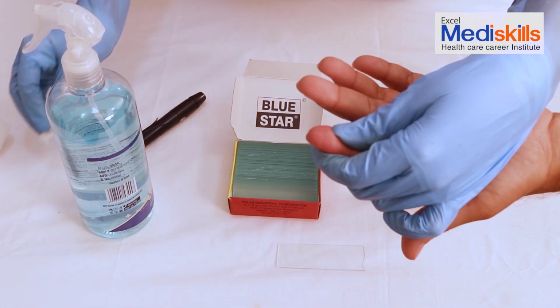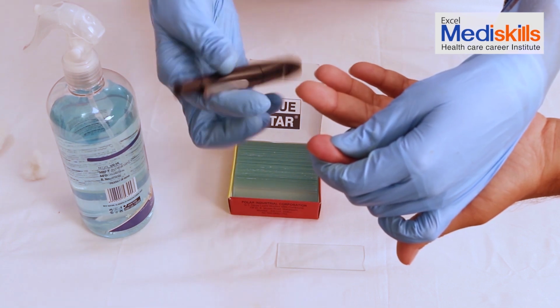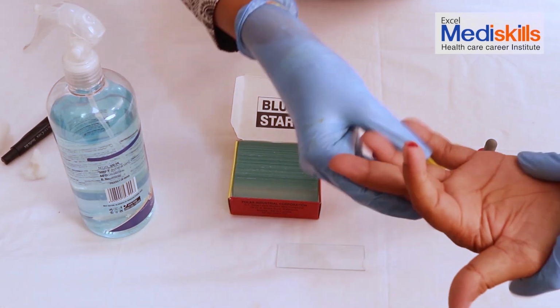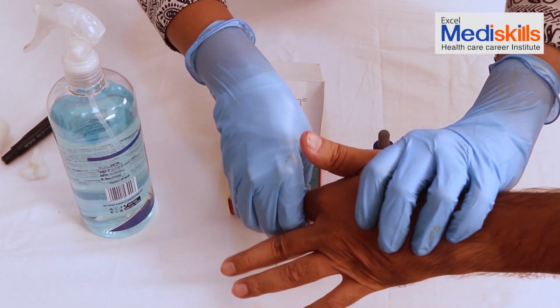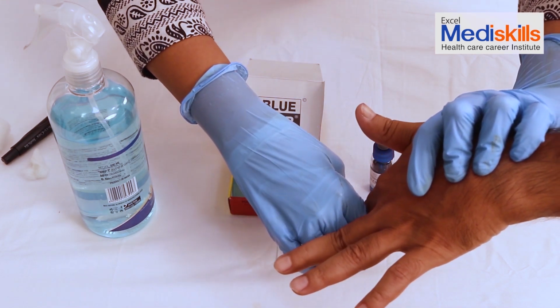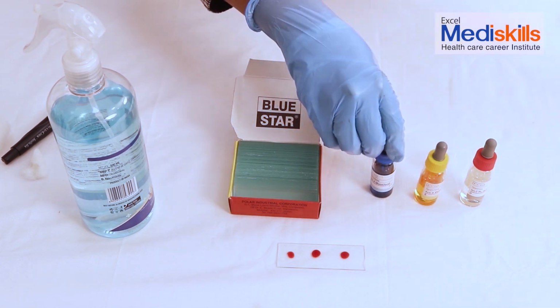Next, if we press it here, then the blood will start accumulating. And now we prick the needle like this. After pricking, we will take 3 blood drops on this glass slide. Remember, the blood drops should be equidistant from each other.